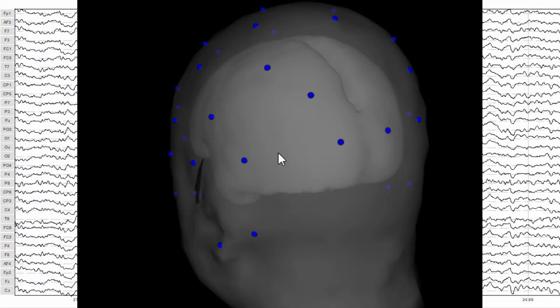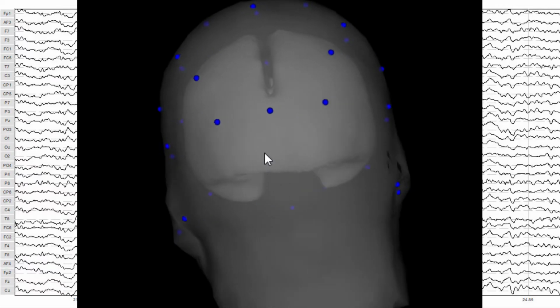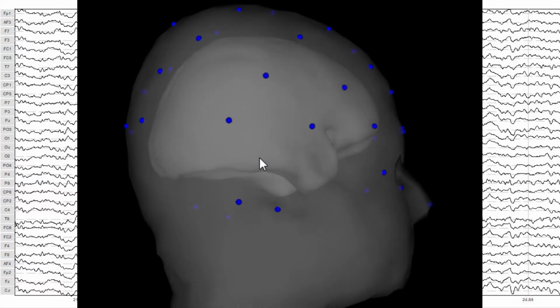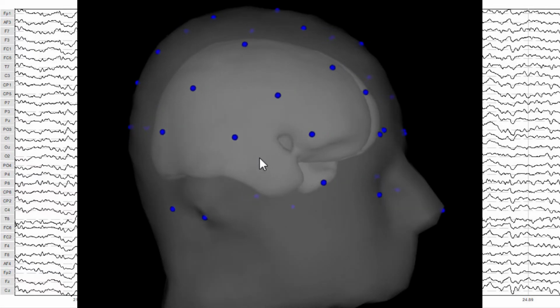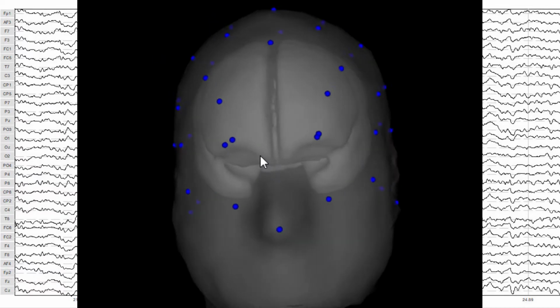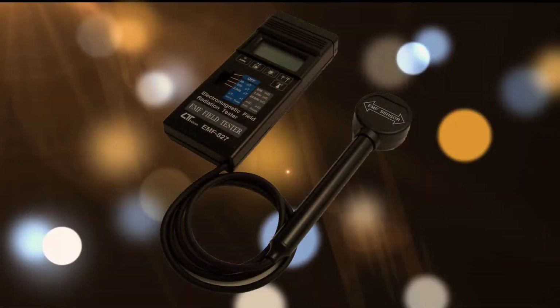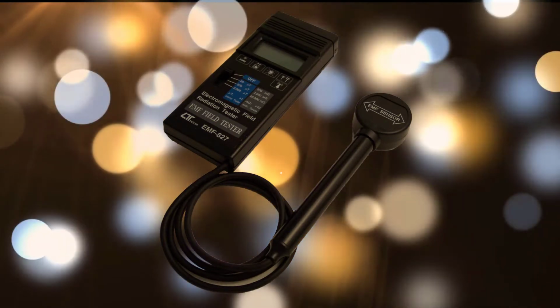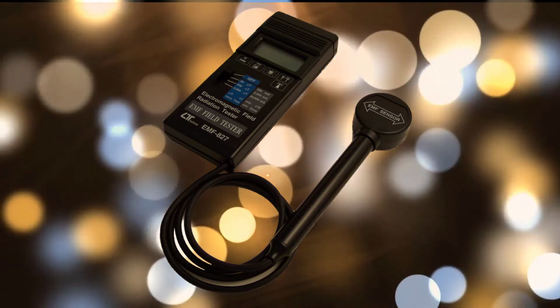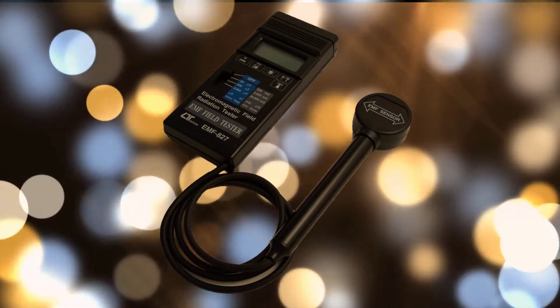For the most part, if you abide by best practices in terms of keeping electrode contact impedance below the acceptable threshold, 3 orders of magnitude less than the input impedance of the EEG equipment, then any interference that is conducted, capacitively or inductively coupled into the body, will be common mode, and any interference that is radiated will be differential mode. The gaussmeter test is most useful in measuring radiated, mostly differential mode interference that may be present in the environment. Examples include motorized devices like fans, pumps, generators, etc.